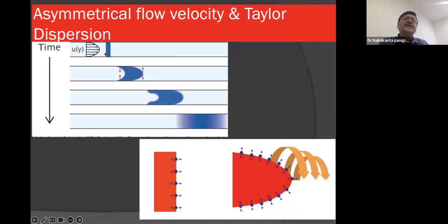If we are putting in a gas flow, you can see this laminar flow here. But in HFO, the frequency of the gas pushed into the tubular structure, which is not exactly a tubular structure, the branching pattern of the bronchus and bronchioles. When this type of asymmetrical flow generates, you can see the area of diffusion, instead of a horizontal line here, the area of diffusion is more.